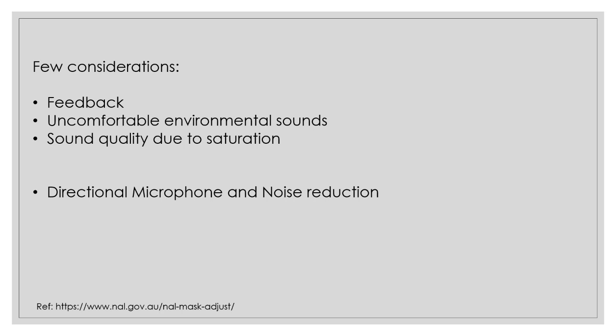Every single hearing aid manufacturer has come up with their own set of recommendations for mask mode. Among that, Signia has come up with a mask mode in their app, so you just need to switch it on. You won't even change anything in the software. But for Phonak, Oticon and other hearing aids, we have to manually set this mask mode as one of the programs. So when a patient is speaking to a person, they will switch their hearing aid to the mask mode. And after they come back to a normal place where they don't require it, we are going to switch that back to the normal one.